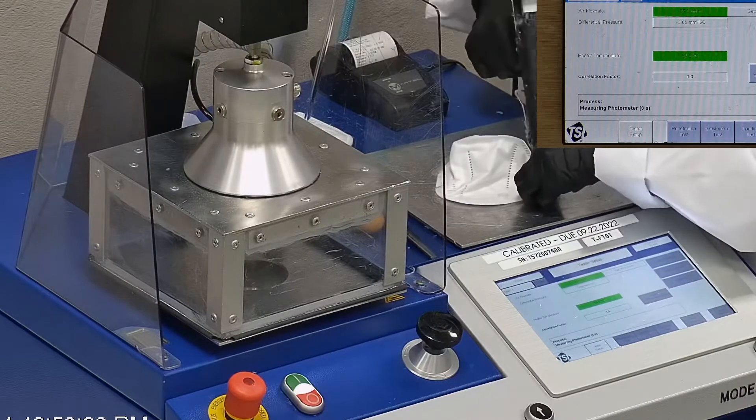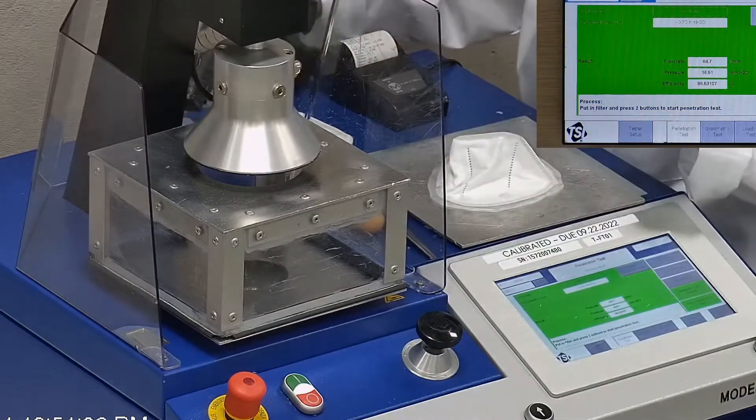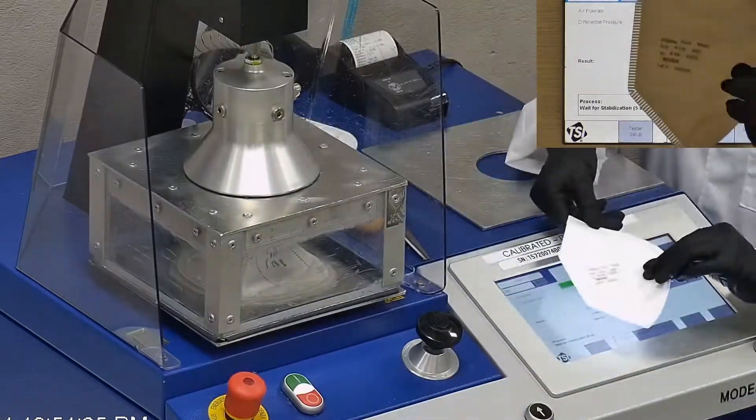Now that you saw how it fit my face and I gave you some feedback, let's go ahead and see how they perform with our TSI machine and see the filtration percentage along with the breathability. This is our TSI machine. We use it to test the particle filtration efficiency of a respirator or mask.